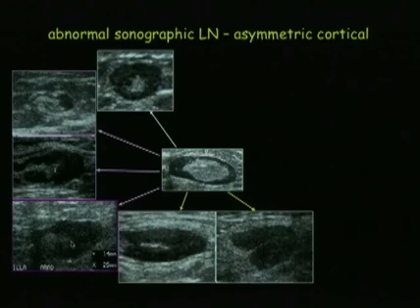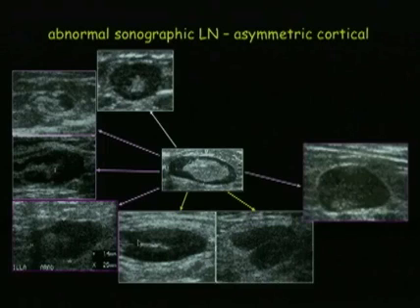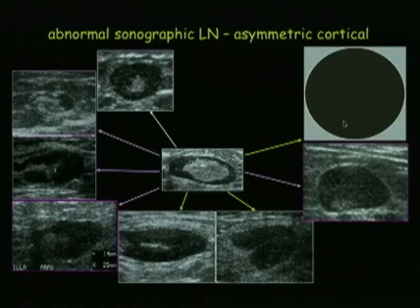These two lymph nodes have a compressed mediastinum. There is symmetrical cortical thickening, but it's so severe that the hilum or mediastinum is compressed to a thin line or a slit. This is still nonspecific. This occurs commonly in reactive nodes. So I've put a white line around it indicating that we need to look at our first tiebreaker, the adjacent lymph node. Here's a case where the hilum is displaced out of the lymph node. This is very clearly the same as eccentric cortical thickening because the cortex is clearly thicker here than it is here, and I put a red line around it because that indicates metastatic disease until proven otherwise.